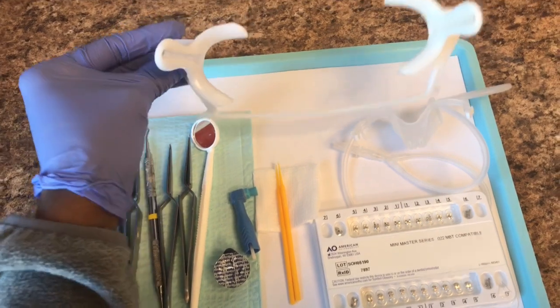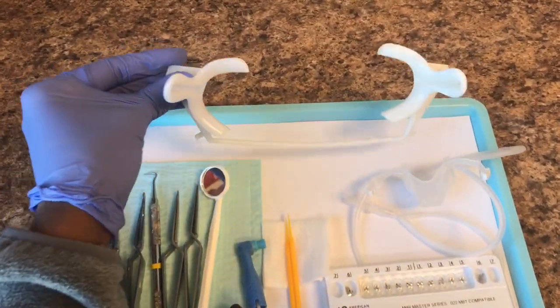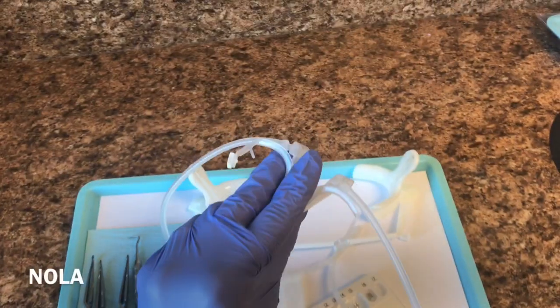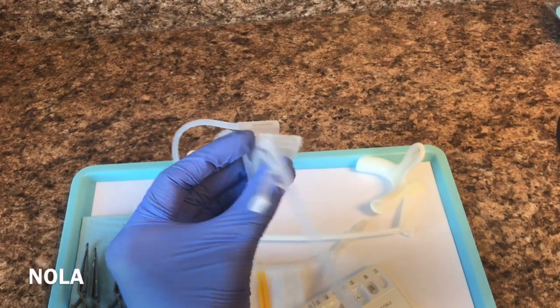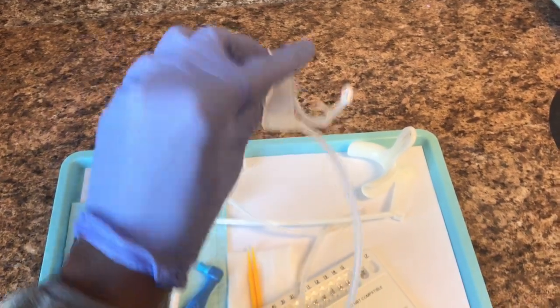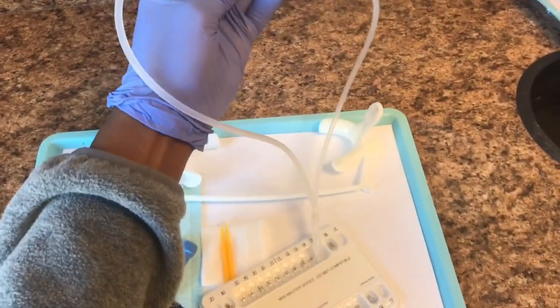These here are cheek retractors, used to keep the patient's mouth open so we can get all of the brackets on. We also have a NOLA here that is used to keep the patient's tongue back. Our suction stays connected to this NOLA, which allows the saliva to run through these tubes here, keeping the patient dry.